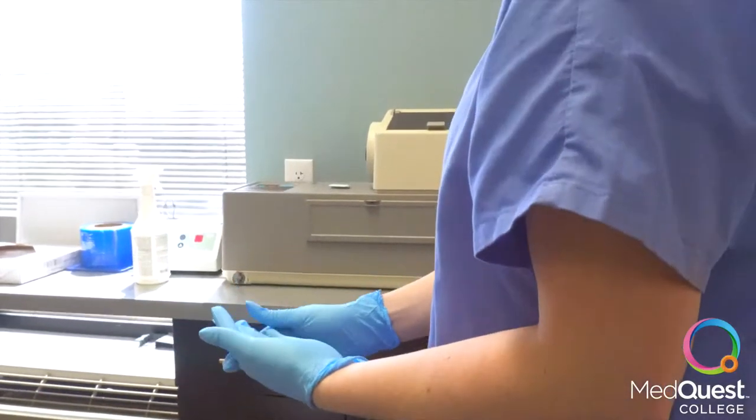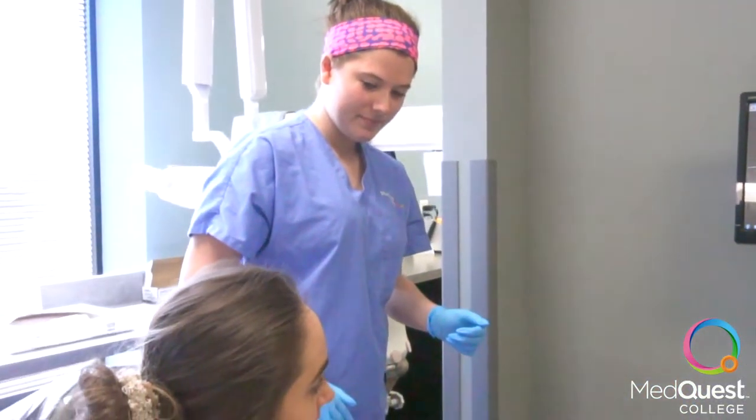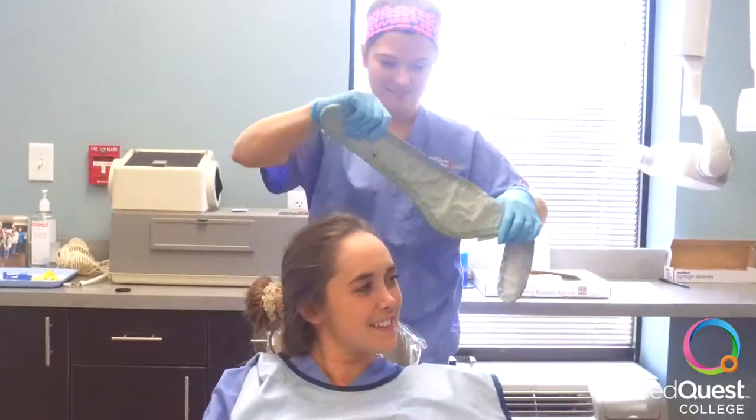Then, put on your PPE and set the chair to the appropriate height. Put on a lead apron and thyroid collar to protect the patient from radiation.